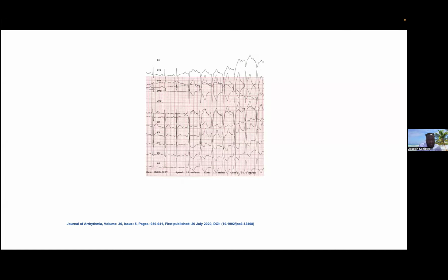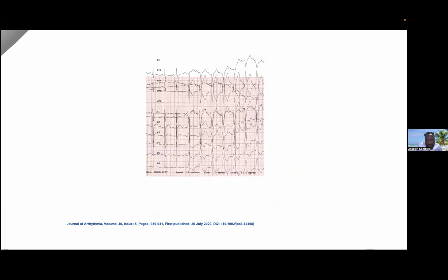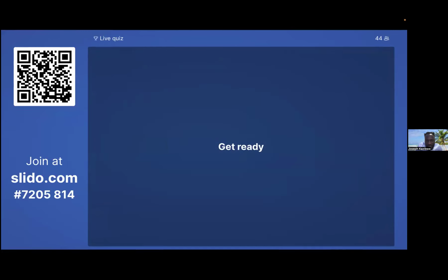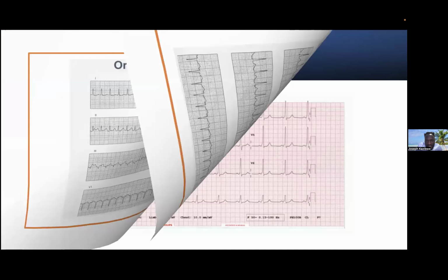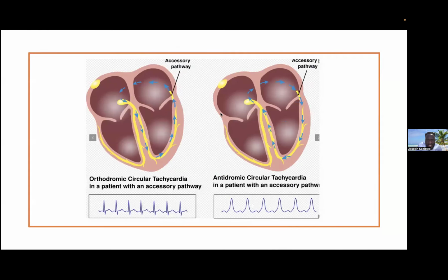I suspect many of you have used it. So in the other example, we are seeing a short PR. Why a short PR? Remember the AV node, I don't know if I have that slide. No. Okay. So I'll just come back a little bit just to explain those features. So two main things we've seen on that slide.